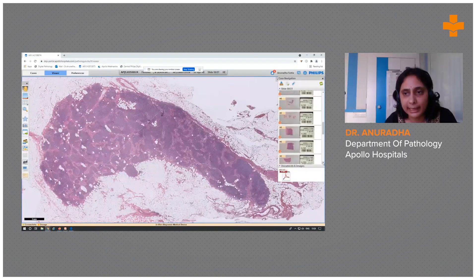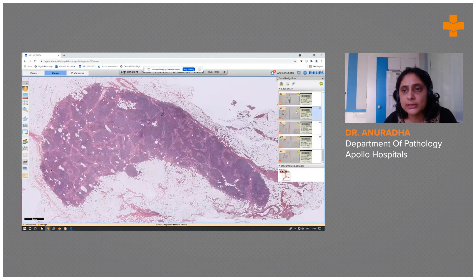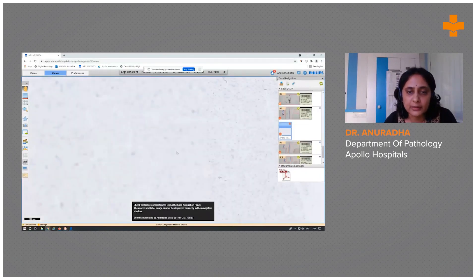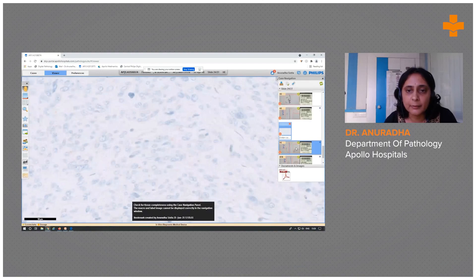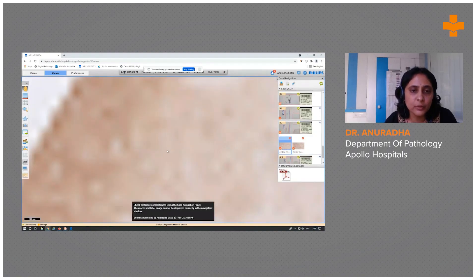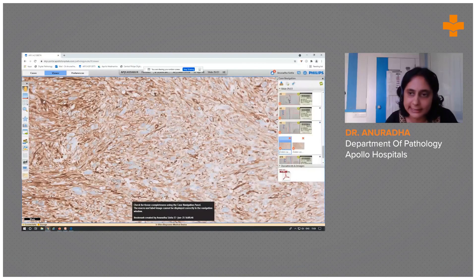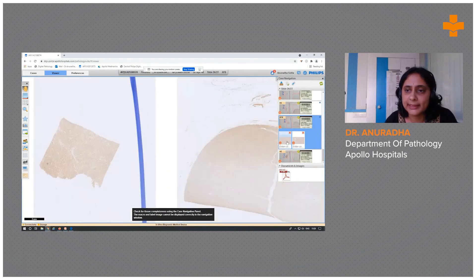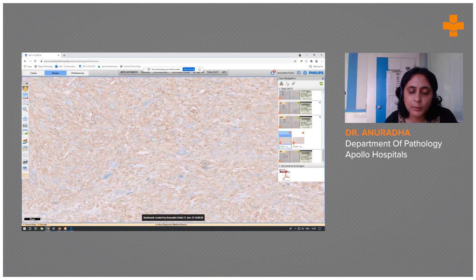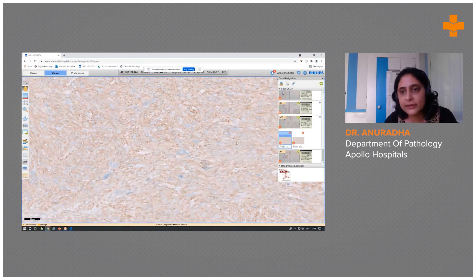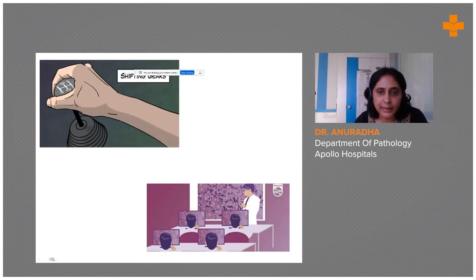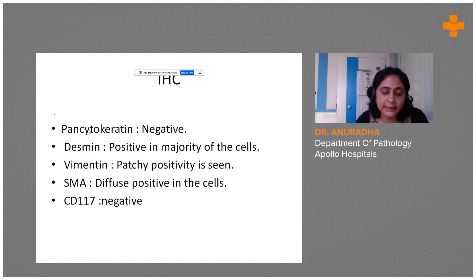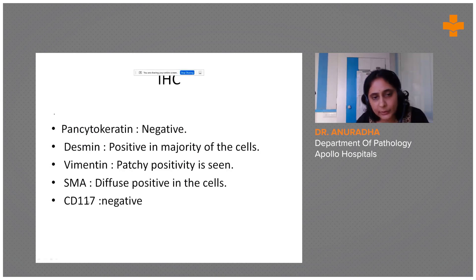We performed a battery of IHC panel. The tumor cells were clearly negative for pancytokeratin. They were diffusely positive for desmin and also positive for SMA. CD117 was negative. To summarize the IHC panel: pancytokeratin negative, desmin and SMA positive, CD117 negative.